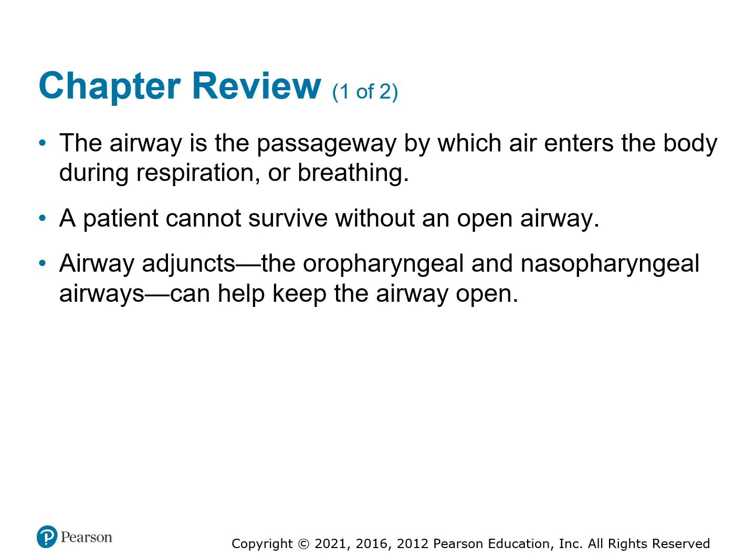So, the airway is the passageway in which air enters the body during respiration or breathing. You cannot survive without airway, breathing, circulation. So this one is all about the airway. Airway adjuncts for basic airway are your OPA and your NPA. They basically help keep the airway open. They do not take over the airway. You still have to maintain some sort of manual control.